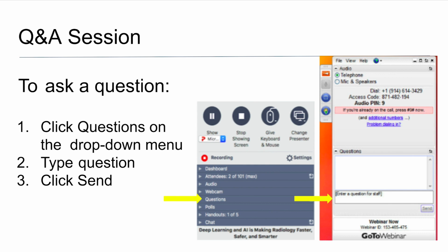And so that's how, in academic settings and industry, people do the simulations. I think a lot of benchmark papers are published this way. We can also do this by taking the first or second or different time point and considering it as a frame. That's how people do dynamic PET, or simulate faster PET. So that's how we do the simulation. It's pretty much the academic standard.